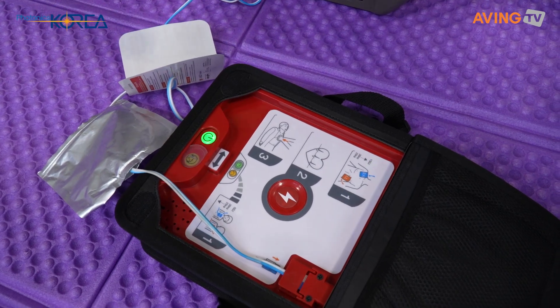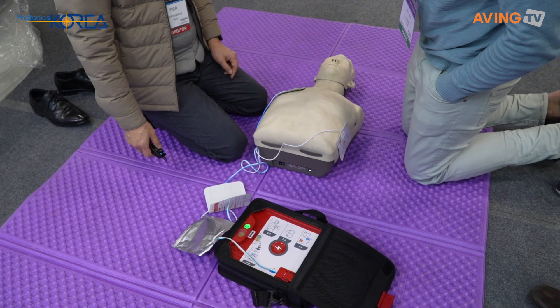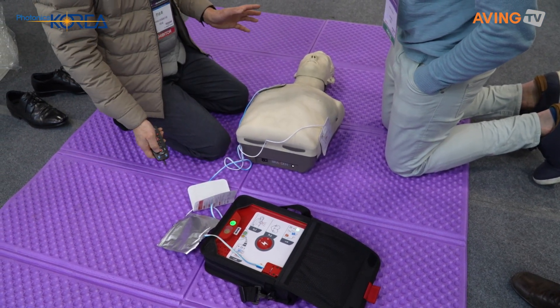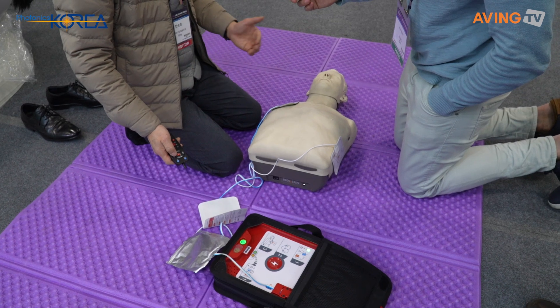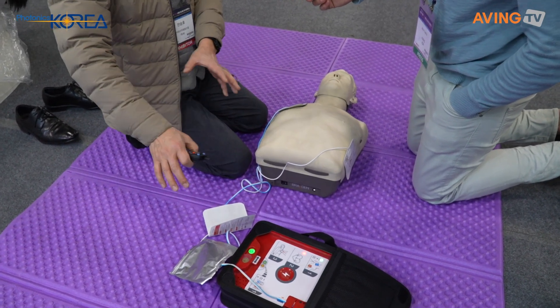The device turns on in adult mode and says: call for emergency medical assistance, peel one pad, check the pads. The device is checking the patient status — don't touch the patient. It's analyzing the ECG and checking the ECG file. The device then decides whether to shock the heart.